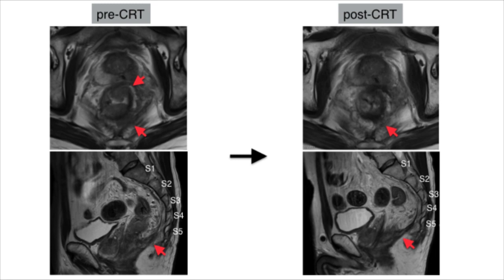We planned to perform a laparoscopic abdominal perineal resection with combined resection of the left side neurovascular bundle and the S5 sacrum.